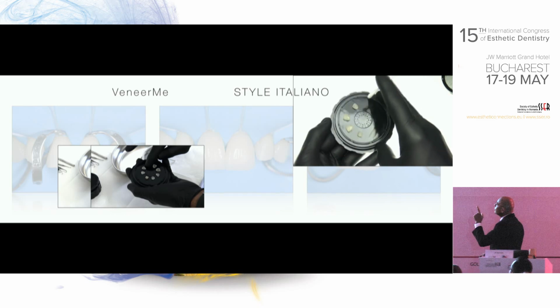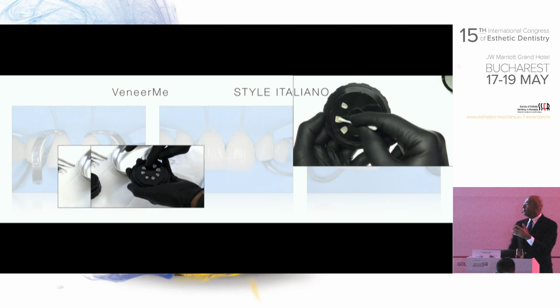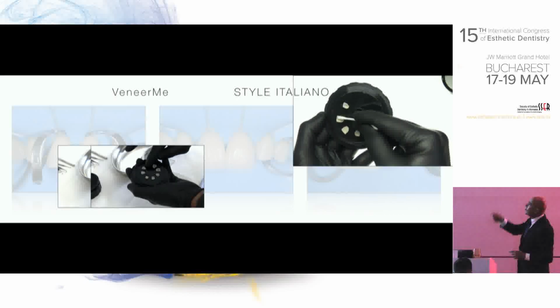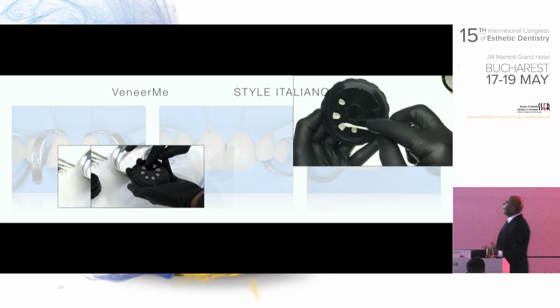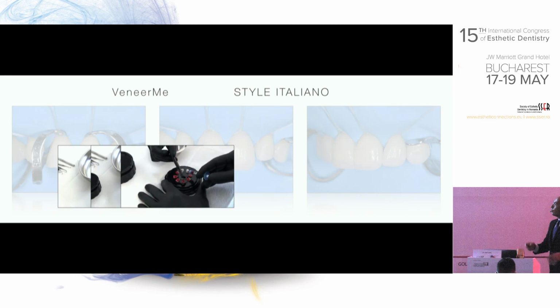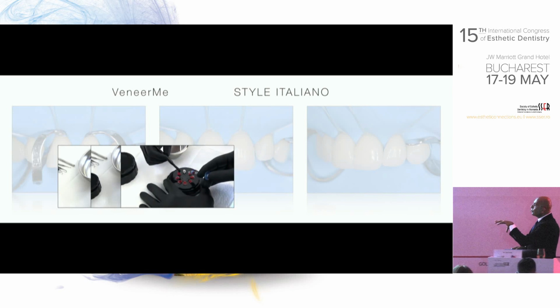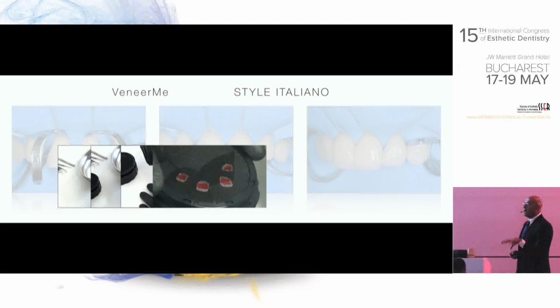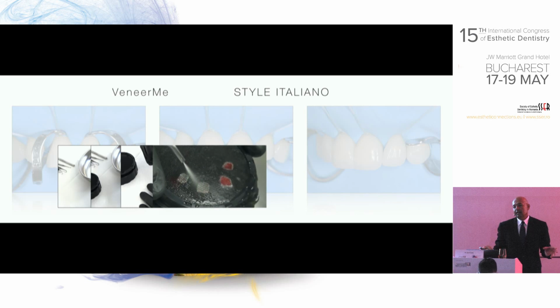You'll have the numbers in the middle, which corresponds to the tooth you're working with, 12, 11, whatever you name, and see how sticky it is. It never moves. See, it bends the Q-tips. And then, once you have this, for example, you'll do etching. Without removing anything, you do the etching. It's already sticked, but you cover it up with the strong mesh on top of this and start washing it out. And when you wash it out, nothing moves.